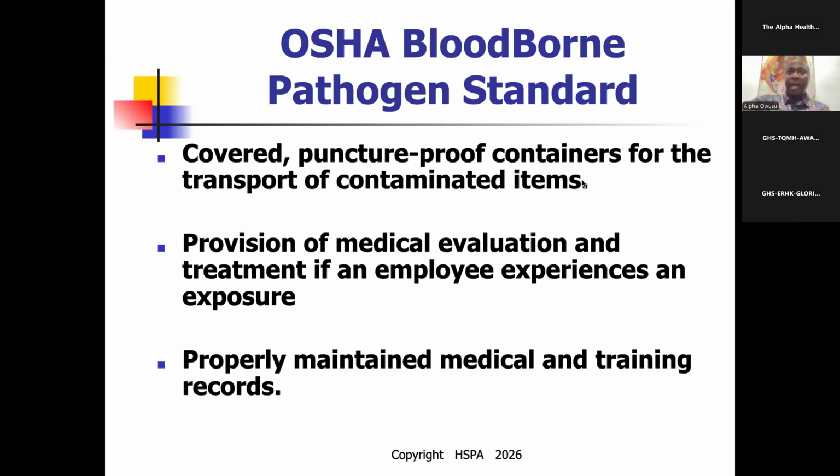Workstation 3, Alpha or Yamensa processed it. He or she processed it at 2:00 a.m. Everything should be documented. When he or she did it, it went to sterilizer number 4. It went to it at 5:00. It came out this time. The biological was incubated at this time. It came out past at this time. So the tray got dry at this time.